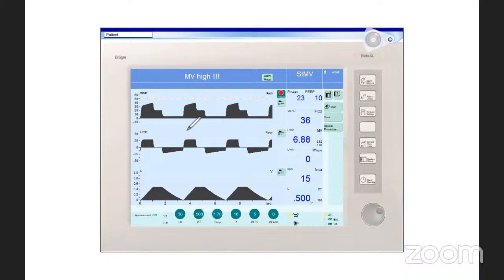So what we see here is first we have the airway pressure that is increased. Then we have the peak inspiratory pressure that is increased. You can see that the plateau pressure is slightly increased here at 22 centimeters of water. The difference between the peak inspiratory pressure and the plateau pressure is increased, that indicates that the problem is airway resistance.